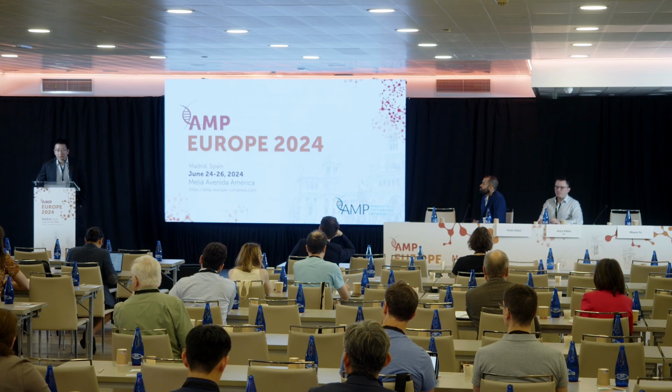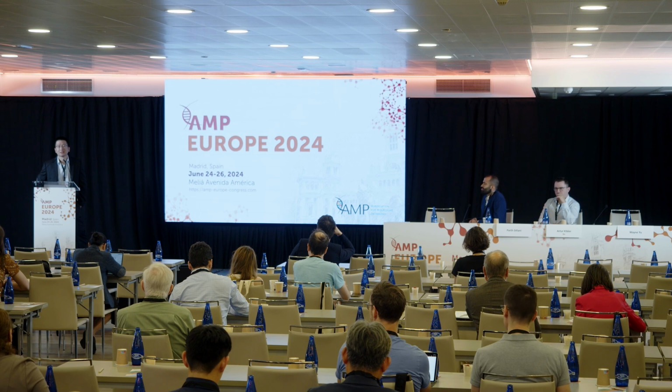It could happen. The primers are similar, but not exactly the same. So we test initially, let's say by FR1, and if it doesn't work, we sequentially reflex to other primers. That's a lot of work and time, especially if you want to get something out quickly.